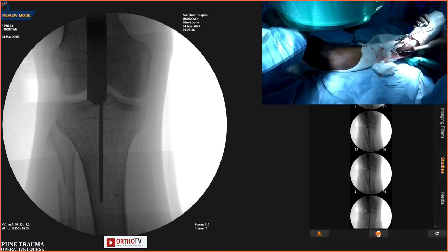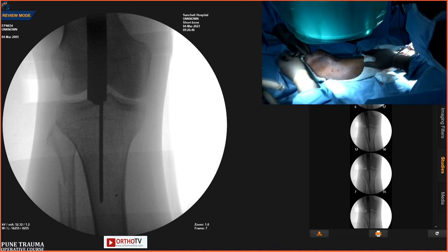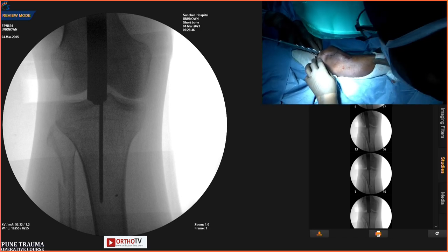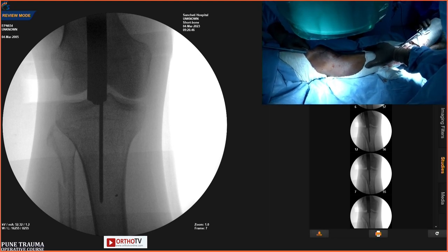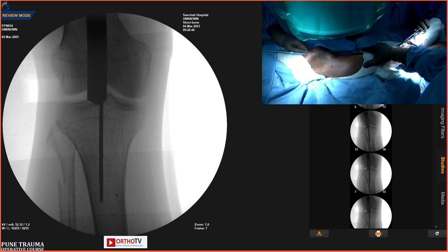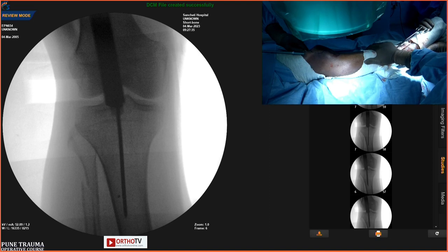Femoral nails are not. But okay, give it. Sir, do you want to check the lateral view once at least before drilling? Yes, we can. There is no issue. First, we want to make this opening. That is very important. Lateral view is important before drilling.